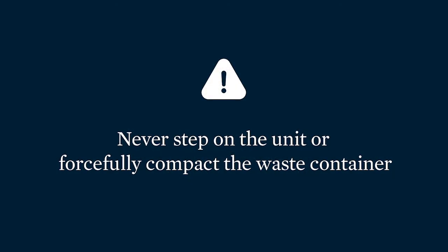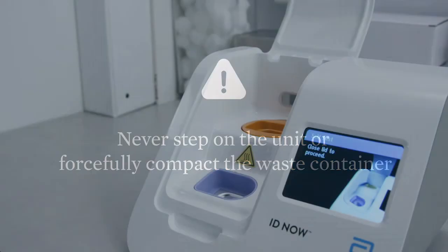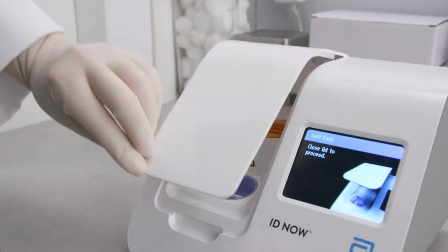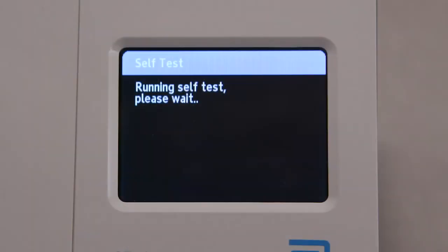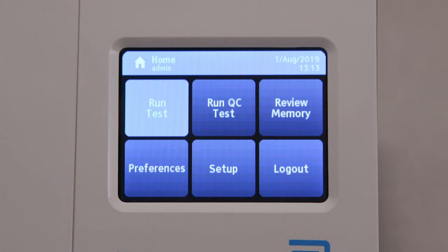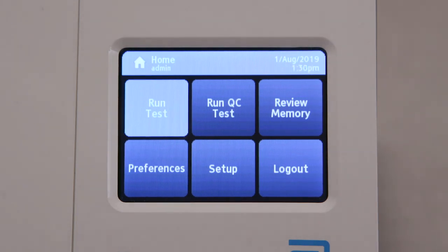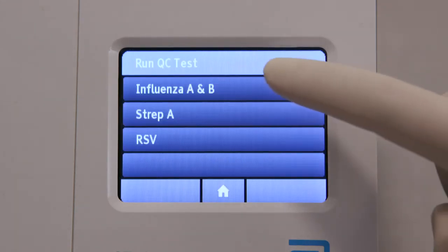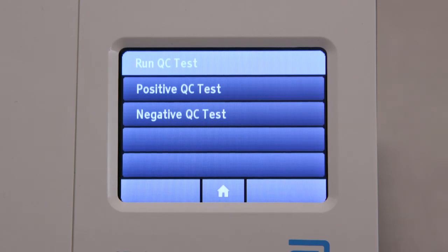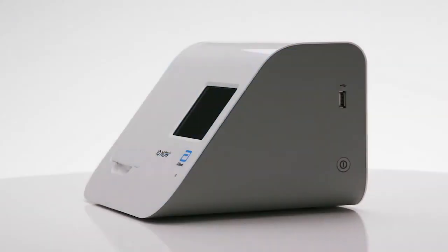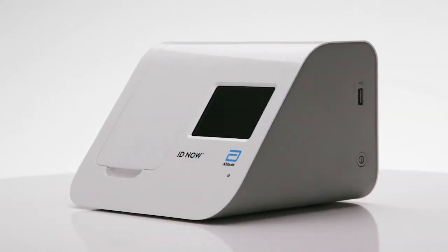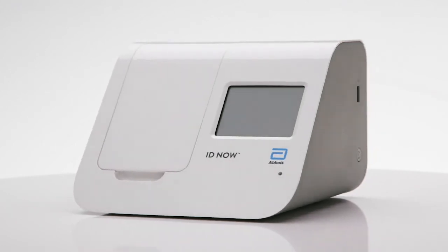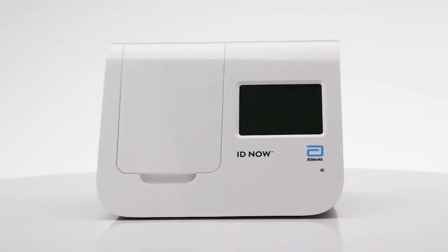Now close the lid. The instrument will run a self-test before showing the home screen or enter patient ID screen, depending on the previous selection. Repeat the same steps you just took for any additional QC samples. You are now ready to perform patient testing. For more information on quality control, please refer to the appropriate product's package insert or the IDNOW instrument user manual. This concludes Module 2.